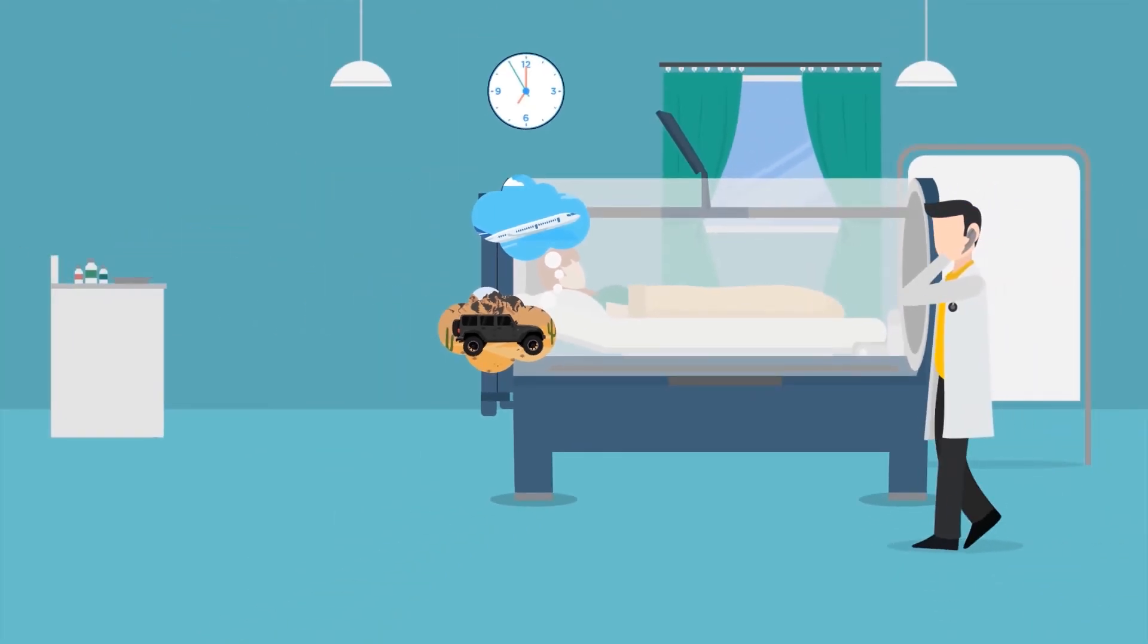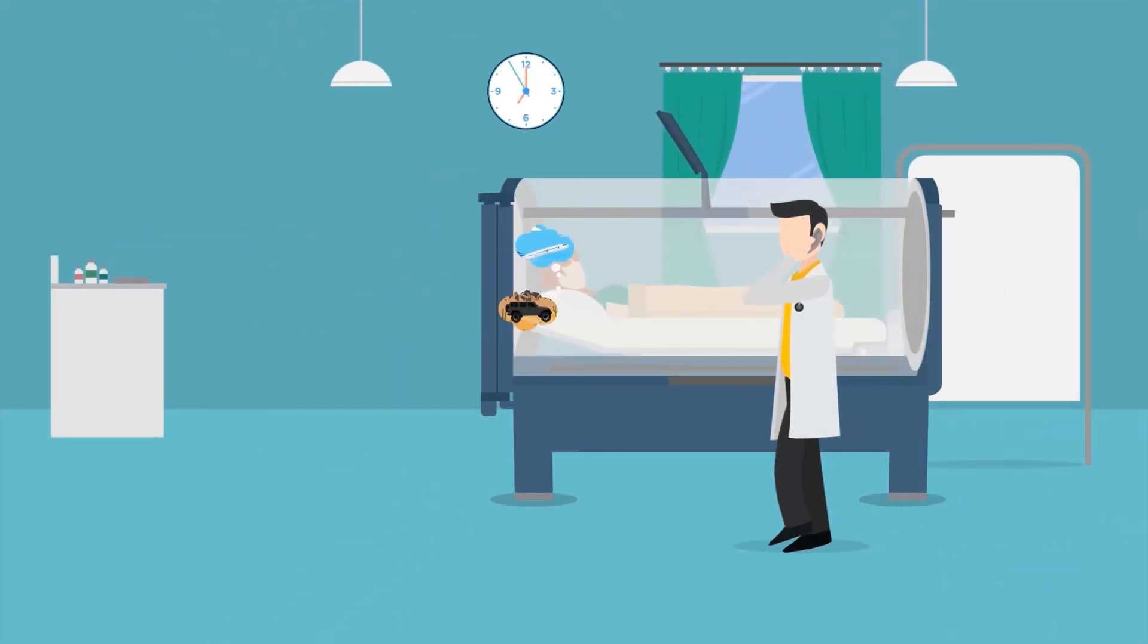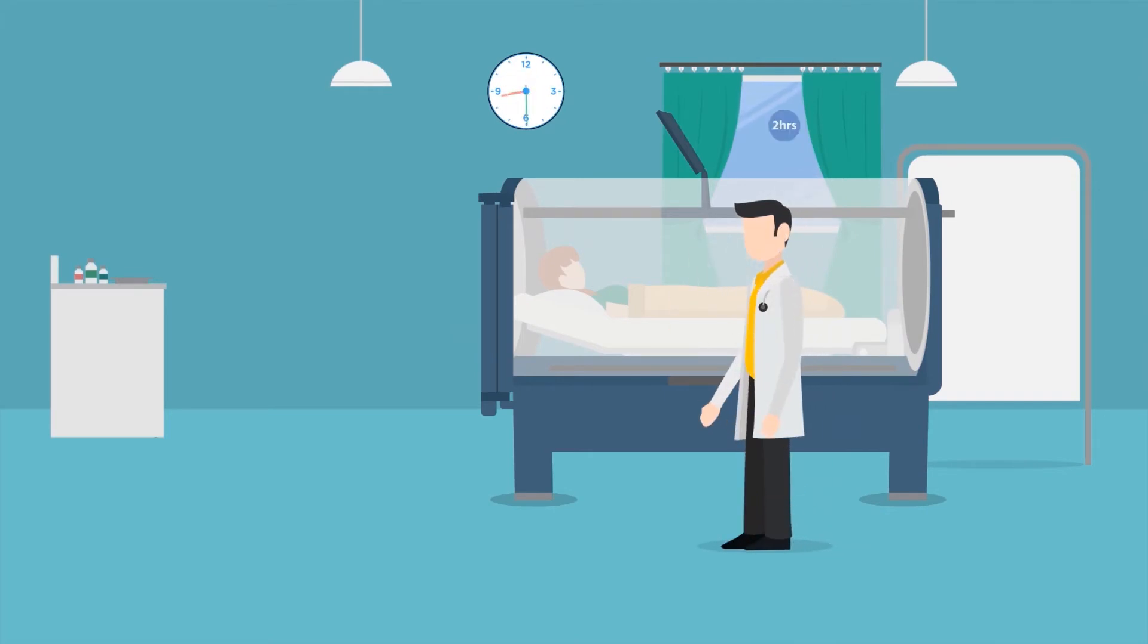But don't worry, the technician will let you know how to relieve this sensation. Your session will last around 2 hours. During this time, you may listen to music, watch television, or even sleep.